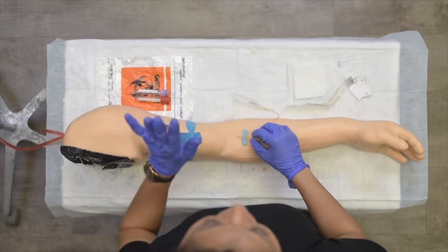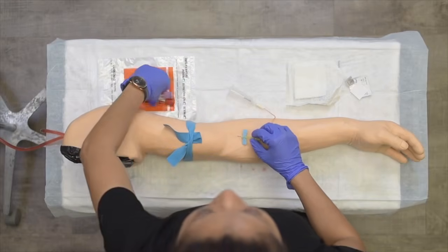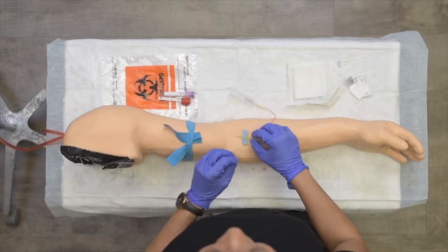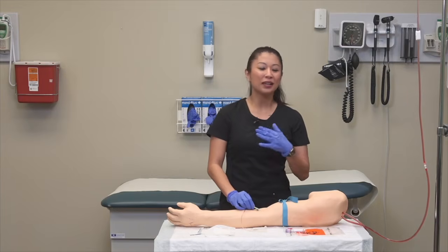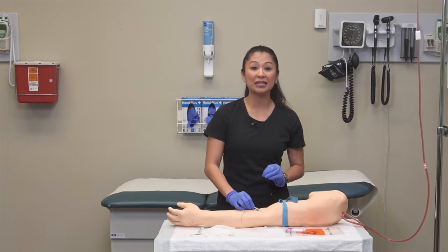Then you will use your non-dominant hand, and that's what's going to help you to insert your blood collection tubes into the blood transfer device. Now just keep in mind here, this is just my personal preference, but I used a butterfly or a wingtip needle.